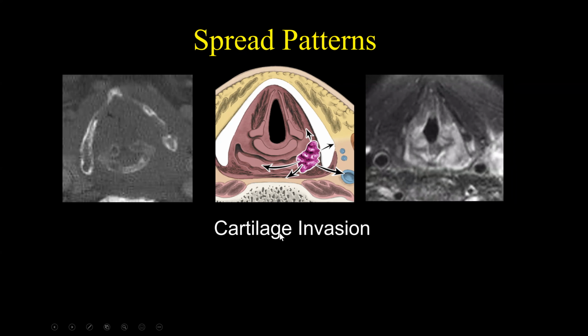The next thing we want to talk about is cartilage invasion. We just had a lecture on larynx where we talked a lot about cartilage invasion. So it happens in the hypopharynx too.